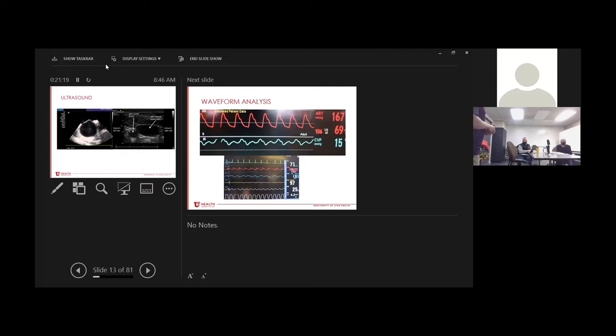After you've placed it, most ED docs who can place a line can get a good view of the right atrium. And if you power flush the central line about a second or two later, you're going to see shadowing. You're basically going to see static in the RA. You're going to see the turbulence of that line being flushed. You're going to see that at the bedside a lot, just to confirm, hey, you guys are good to use this line. We're still going to get an X-ray.